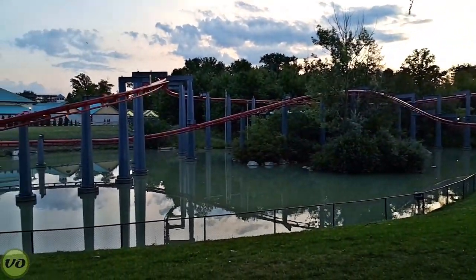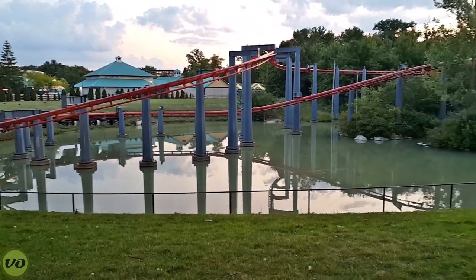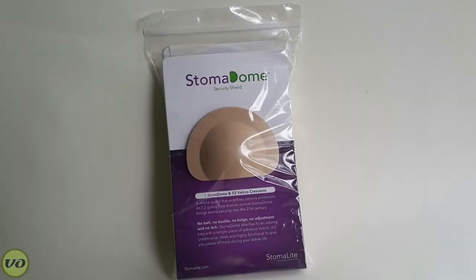I just got off Vortex — actually my first time on this ride. The harness comes over your head and right over my stoma, at least, and no problem at all. The Stoma Dome worked really well. I had no issues — it was a great ride.